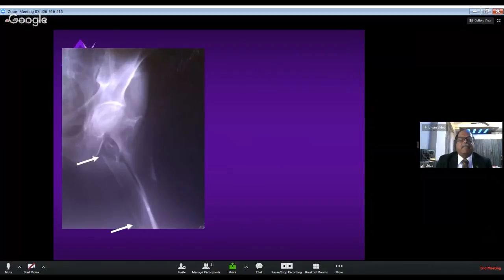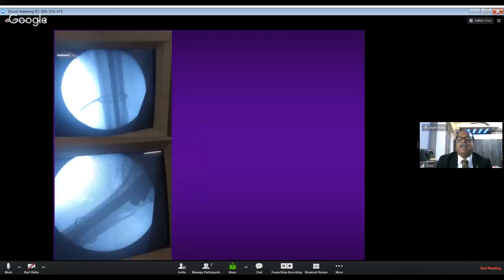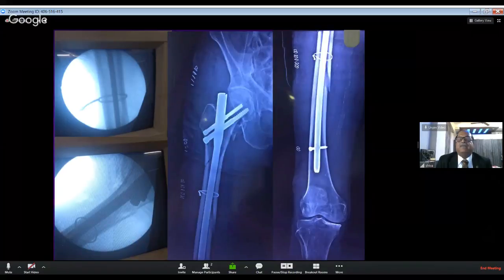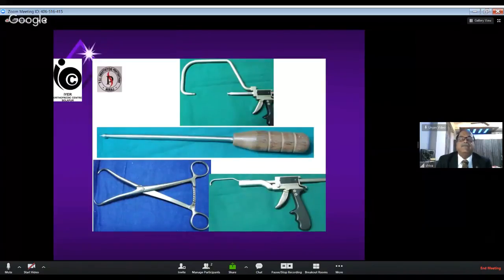Here is another example of a long oblique fracture with the tip going almost up to the lesser trochanter. I used the cerclage wire passer, reduced the fragment through a small incision with encerclage wiring, and this is the end result. You can see that the medial part of the weight bearing axis has been beautifully restored. That is the reason why I have used the technique. You can see with a small incision, without disturbing the hematoma, it can be done using these instruments. There are many other instruments like ball-tipped guide wire, ball-tipped spike, then reduction clamps, collinear clamps, all are available. With the use of these, our reduction maneuvers are becoming possible with small keyhole incisions.